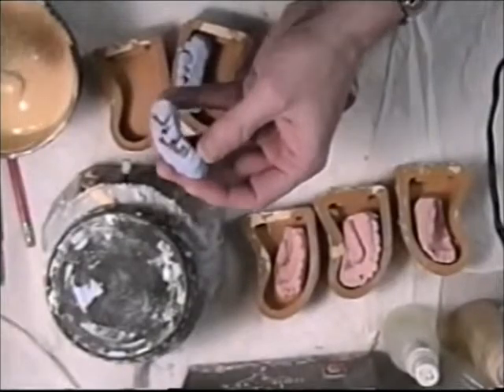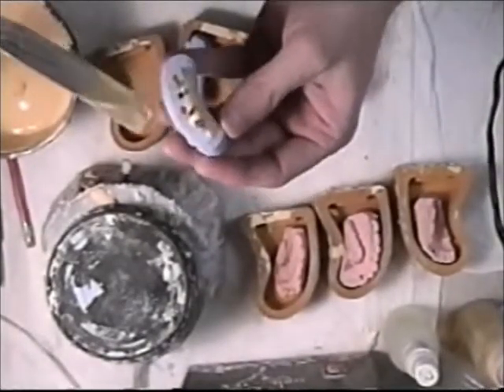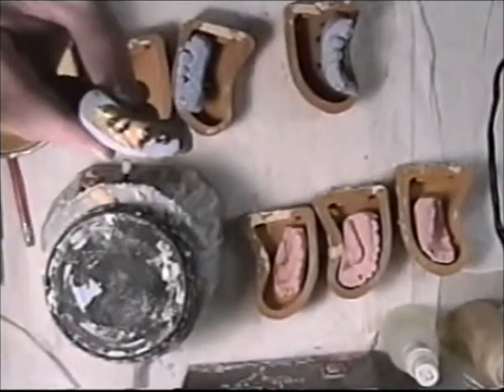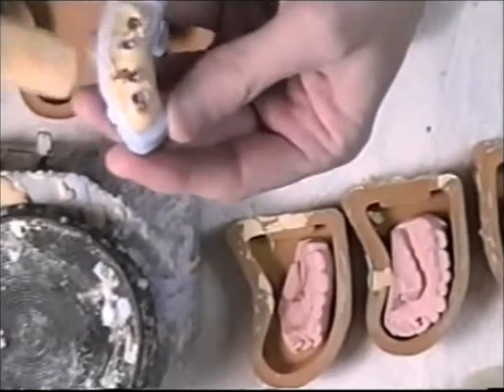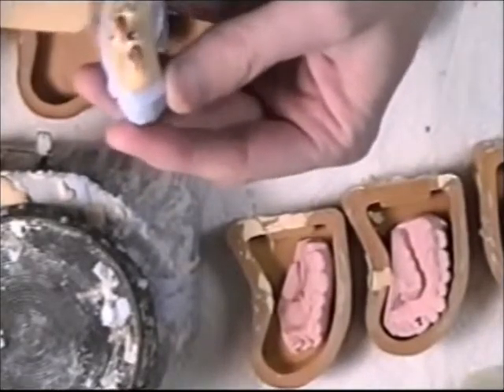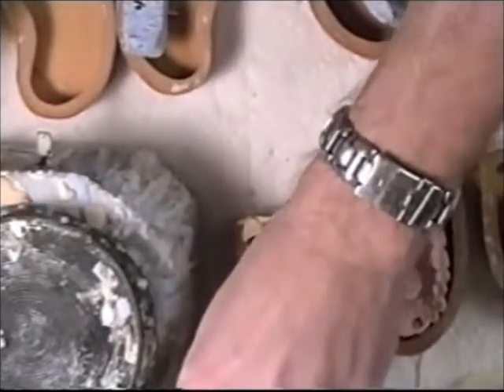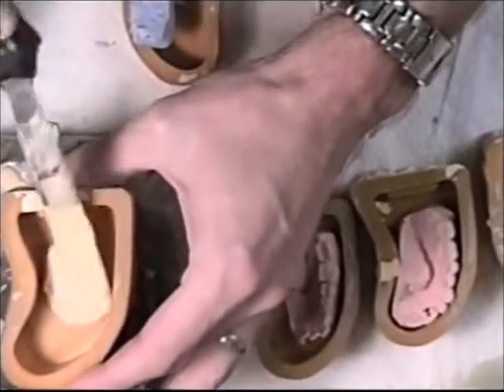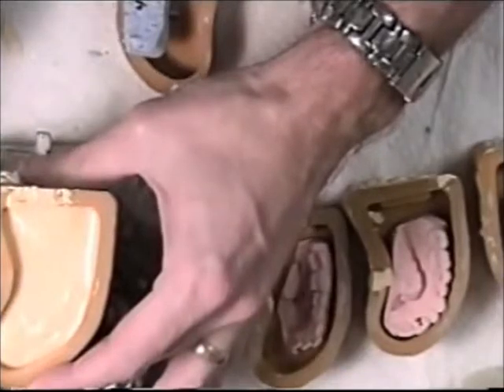I use my spatula now, just placing it between the dowel pins and the reverse dowel pins. Then I set it to the side and pour up the rubber mold.